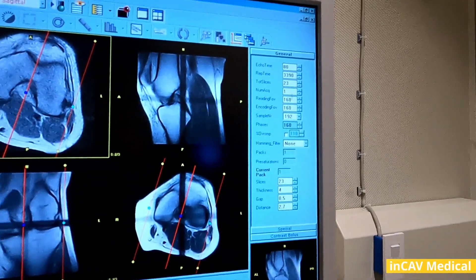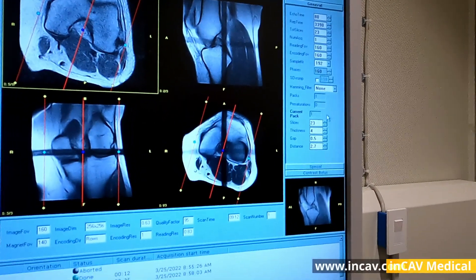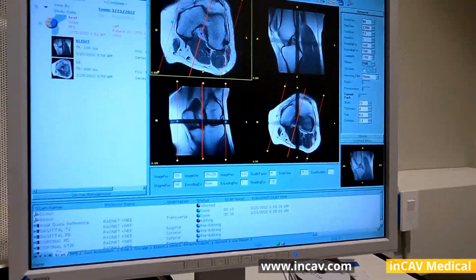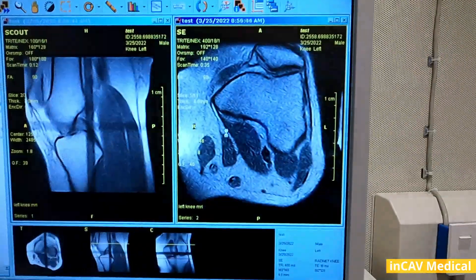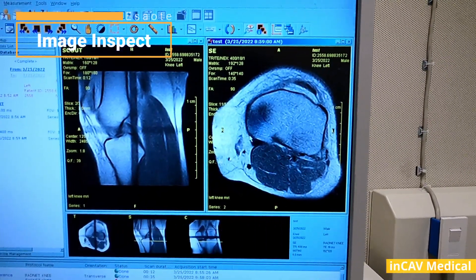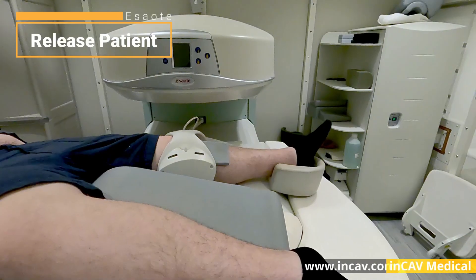Depending on the study, the scan could be from 30 seconds up to 7 minutes. In this case, the study was 35 seconds and the scout image was 12 seconds. Once we finish, we release the patient. The goal is to have the patient the least time possible inside the MRI.